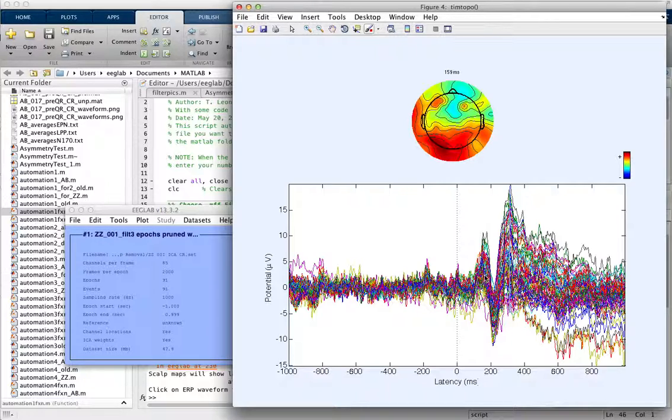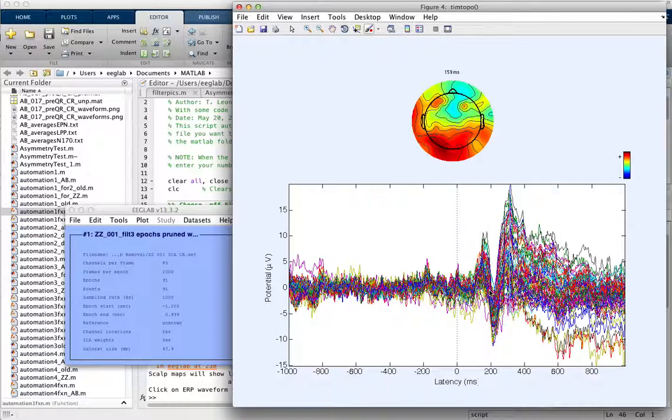What we want to do is interpolate these electrodes, which means that it takes the data from the electrodes around it and guesses what should be at that electrode.